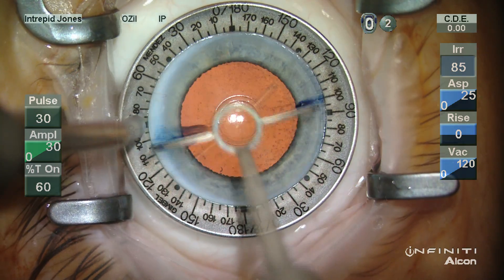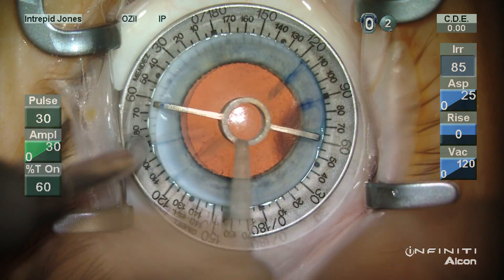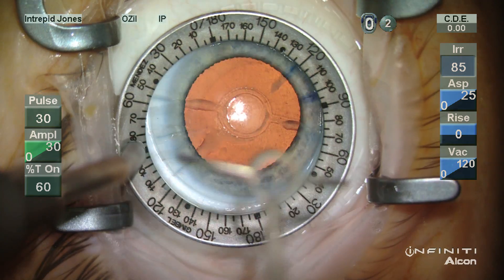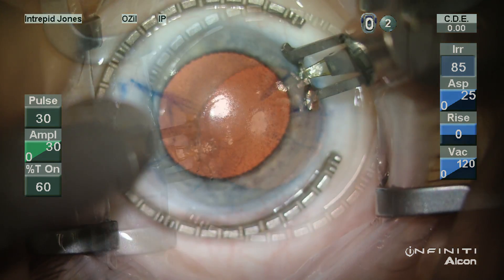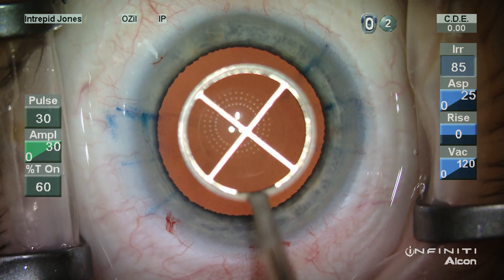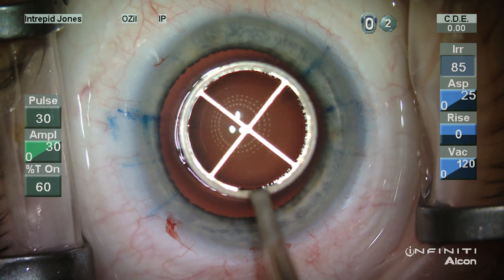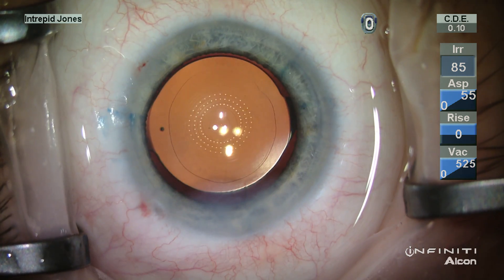This patient has approximately two diopters of astigmatism and desires presbyopic correction, and therefore paired 55 degree arcs are utilized to relax this pre-existing corneal astigmatism. It is helpful to note here the round configuration of the corneal reflex of the keratoscope indicating good correction of the astigmatism.